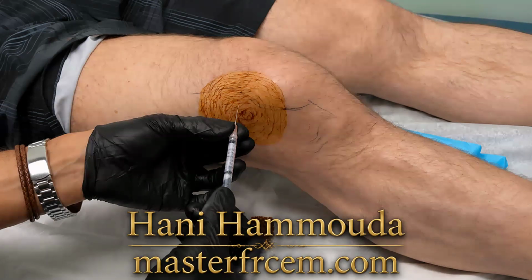The other needle is long. It will be 14 or 16 or even 18 gauge cannula. This one is for deep aspiration or injection of treatment also, treatment like corticosteroid, anything like that. So the landmark is 2 centimeters lateral to the lateral border of the patella.